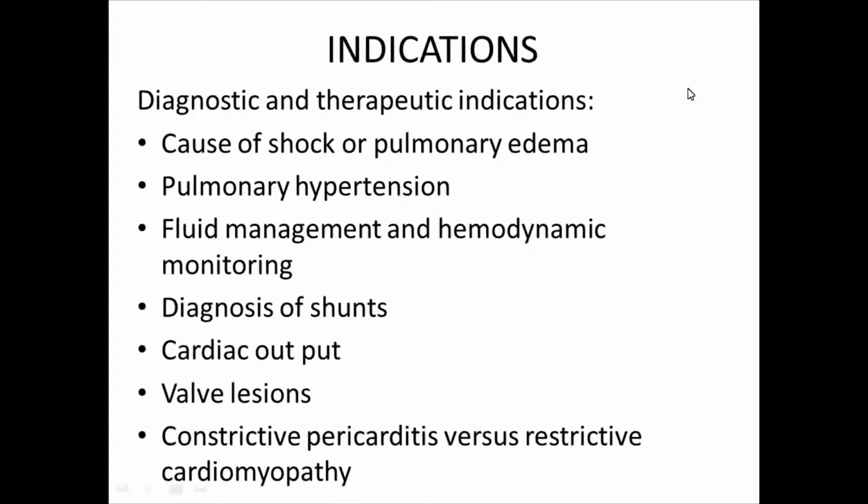As I knew from Hatim last session, you went through some introduction for the hemodynamics. Now I can just review with you quickly the indications, which can be diagnostic or therapeutic for invasive hemodynamics. One of the common indications is to clarify the cause of shock or pulmonary edema in ill patients.